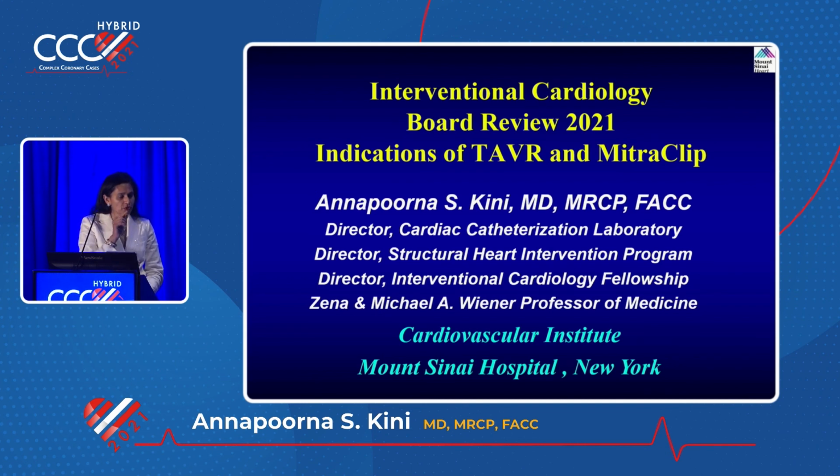But you have to see the animations that we have created, that you use the J wire, get into the cage first, then use the J wire to go through one of the diamonds and come out and then engage into the coronary artery. So you have to see that animation where we have clearly shown you how to engage. But yes, if they ask you that, go for smaller catheters, whatever catheter choice they're giving. You understand the concept: the pliable aortic valve is replaced by the metal cage that is rigid. So you need a smaller catheter. Okay.